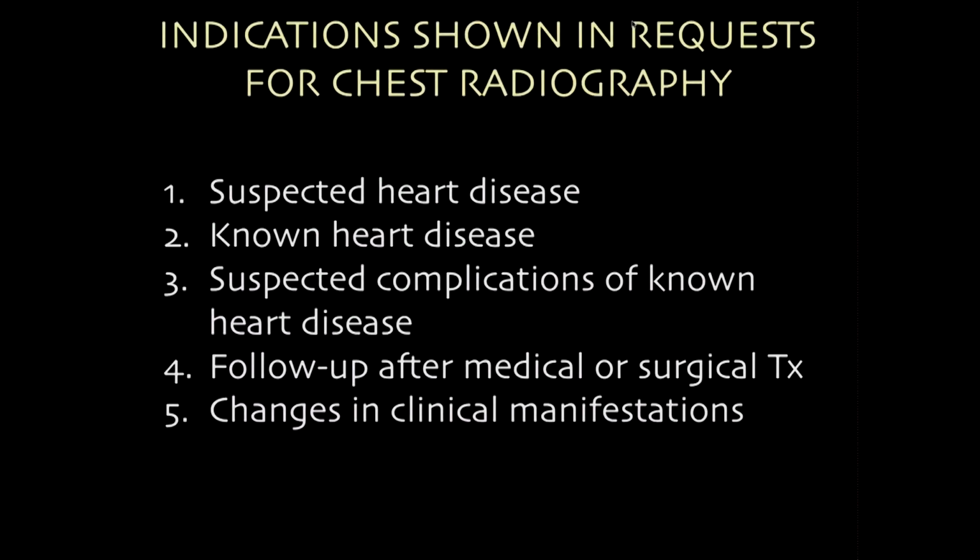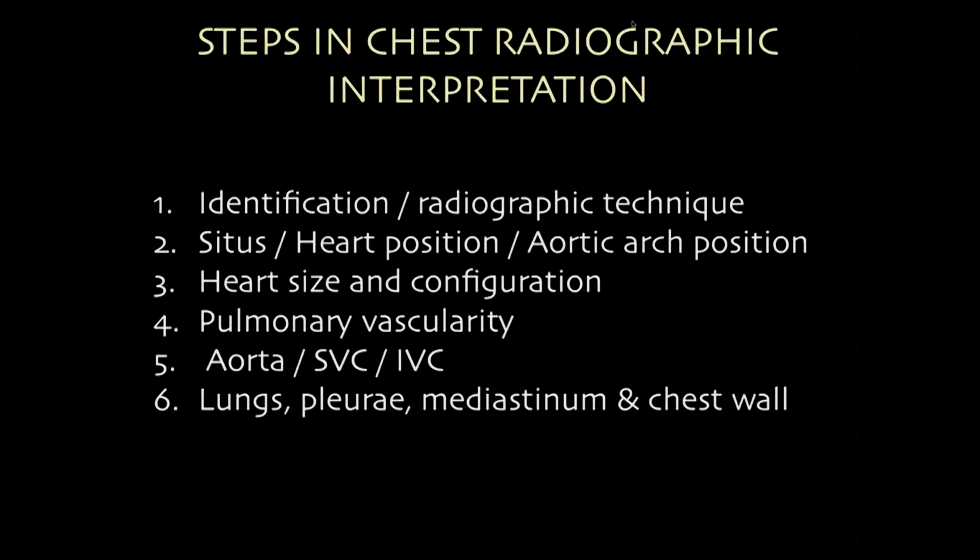The indications shown in our requisition in the hospital for sick children include: suspected heart disease, known heart disease, suspected complications of known heart disease, follow-up after medical or surgical treatment, and changes in clinical manifestations. So this is my recommendation to my residents and fellows on how you approach the first chest X-ray in the hospital as a cardiac patient. We need to look at the identification and the radiographic technique.